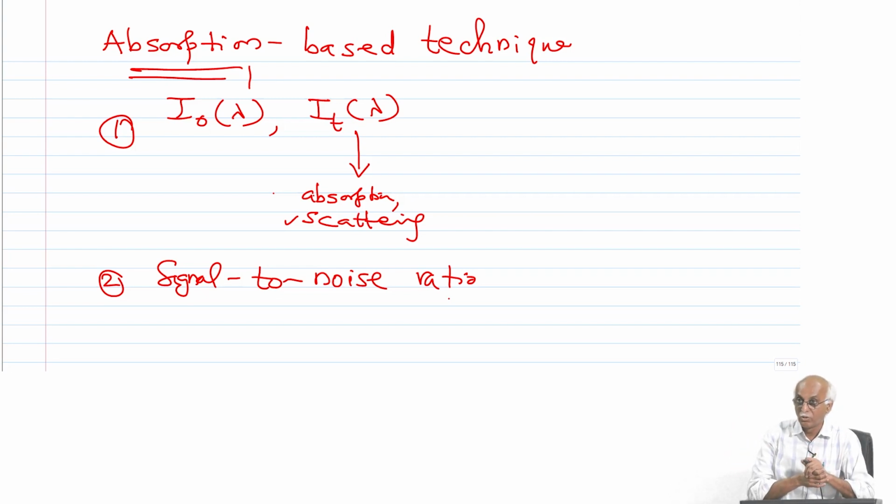A small decrease against the noise of this existing light is very difficult to capture. So, for example, in this room lots of tube lights are on. I have a detector placed here somewhere and it is seeing them. Now, let us say one of the tube lights decreases by a small amount. The detector may not be able to detect that small decrease, because it is already measuring a very large intensity.